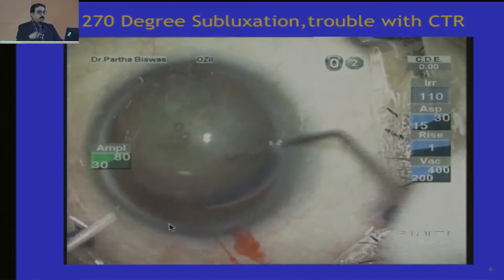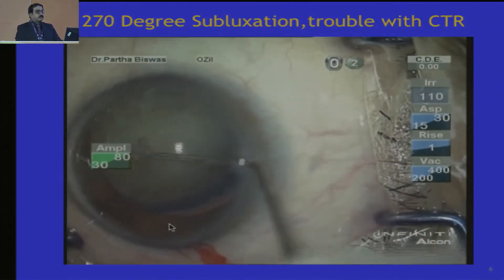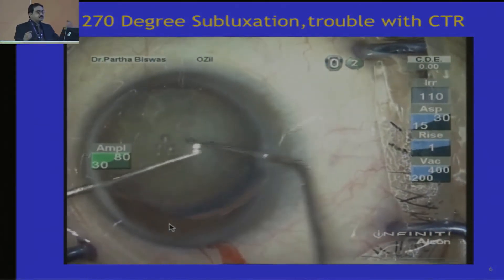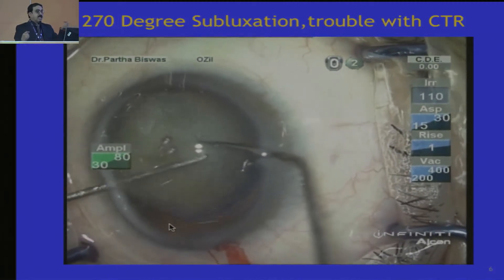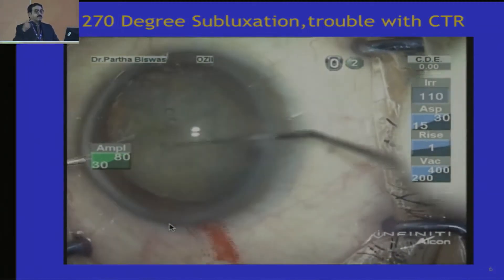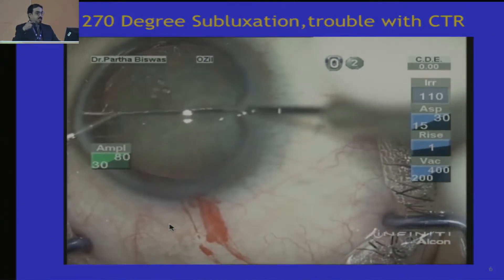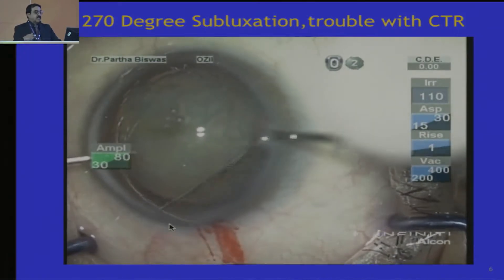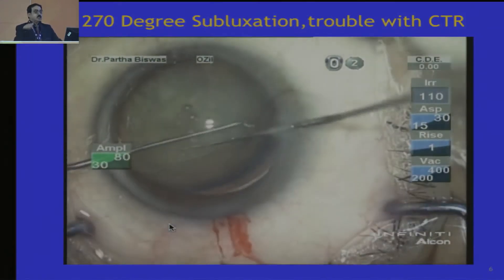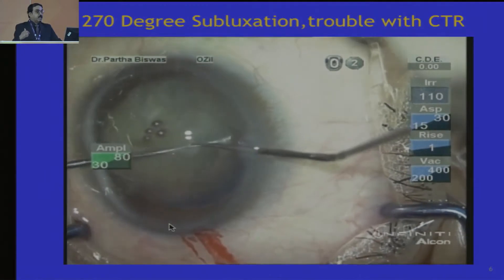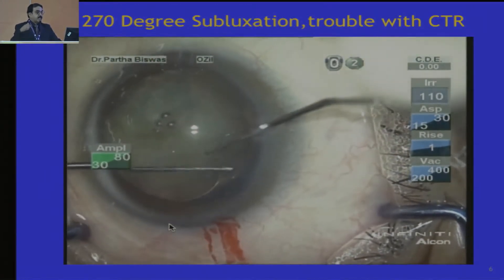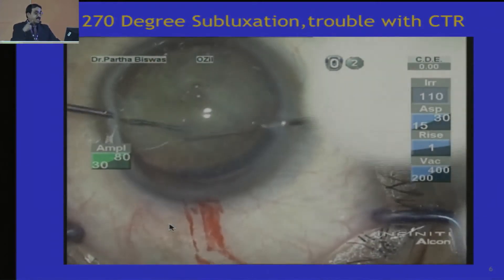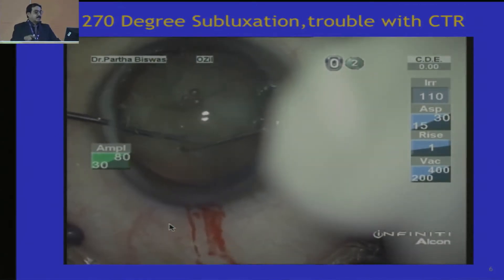Now look at this. I am placing the CTR — what can you see? I am trying to place the CTR and the CTR has gone in through the hook and travelled right into the device through which I am placing it. The Sinski hook has not worked, it has slipped, and now it has slipped into the angle of the anterior chamber. I make a second attempt with another hook from the other end and try to wiggle it in. These things happen when there are large subluxated areas.